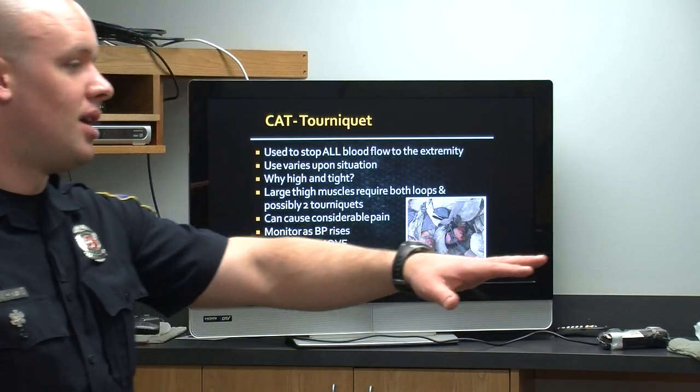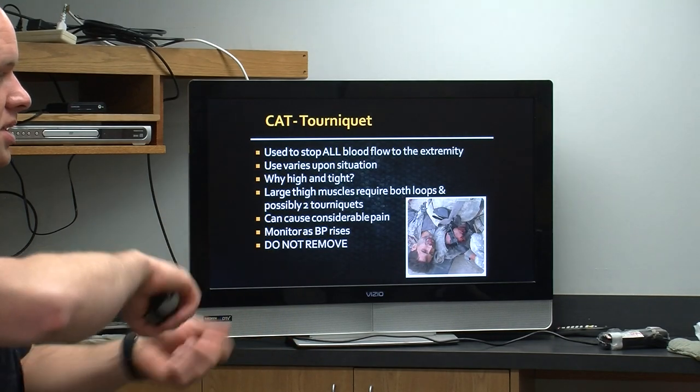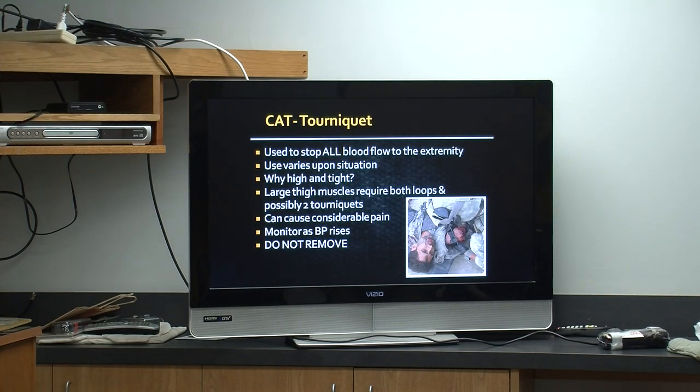So these things are awesome because once you tighten them down, you can continue to tighten them, pull the windlass back out, tighten it up a little bit more, pop it back in. You can continue to keep doing that. Don't take it off.